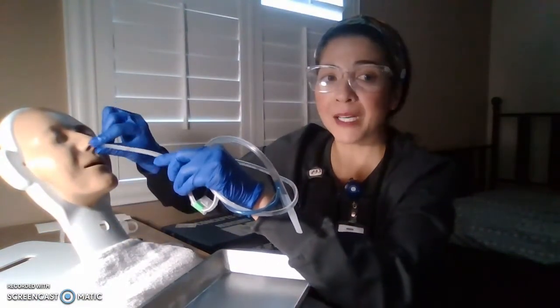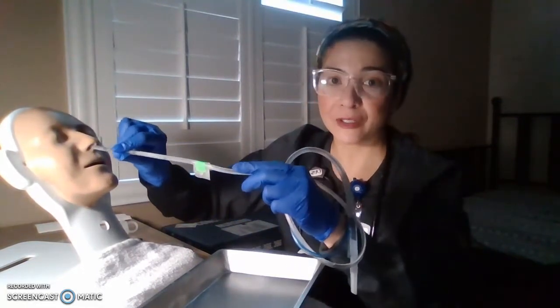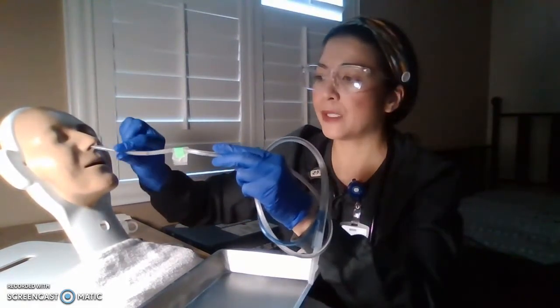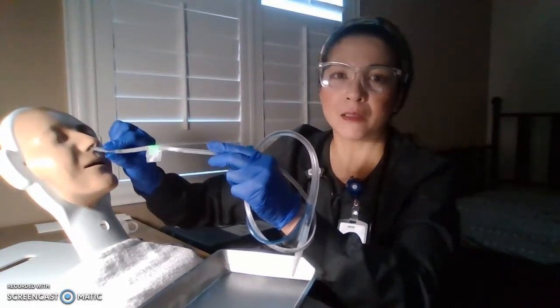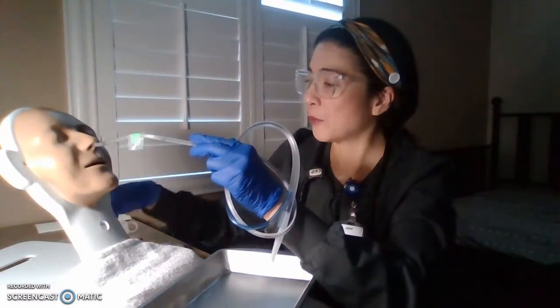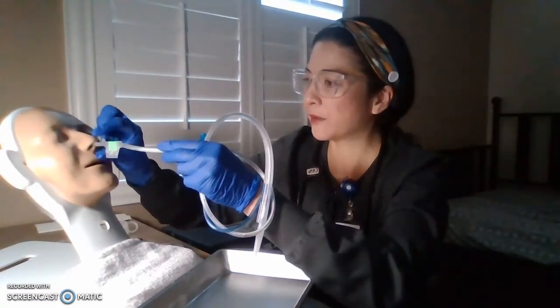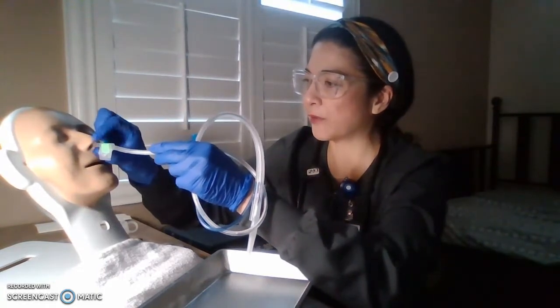So now that we are past that area, it would be easier at this point. Okay. He wouldn't feel that much uncomfortable feeling at this point. Okay, sir, we are almost there. Are you breathing okay? Raise your hand for me. Thank you. All right, so now we reached the point. See how helpful that is.